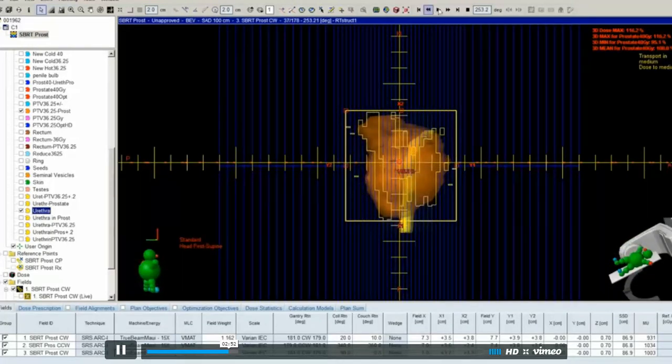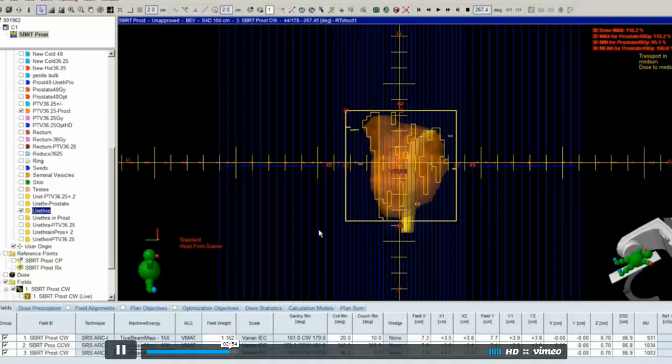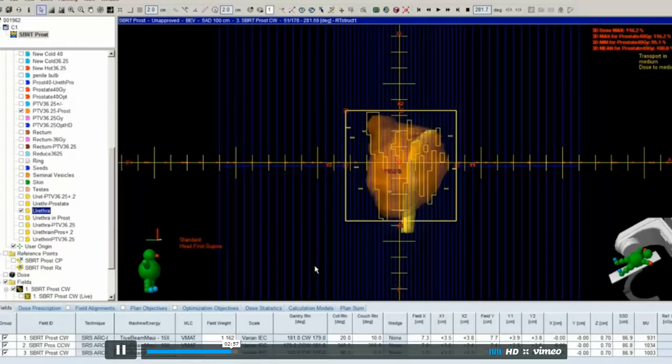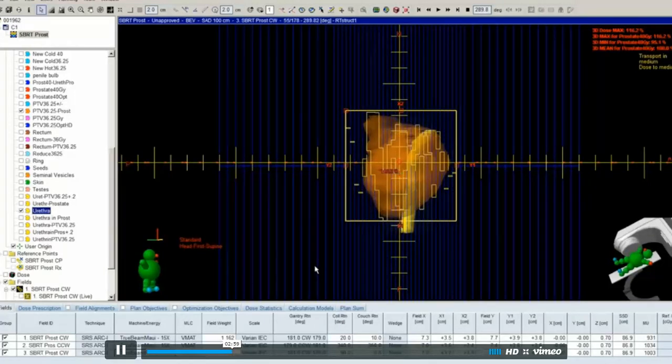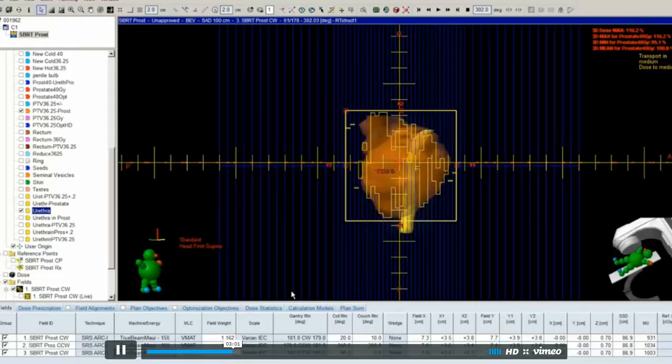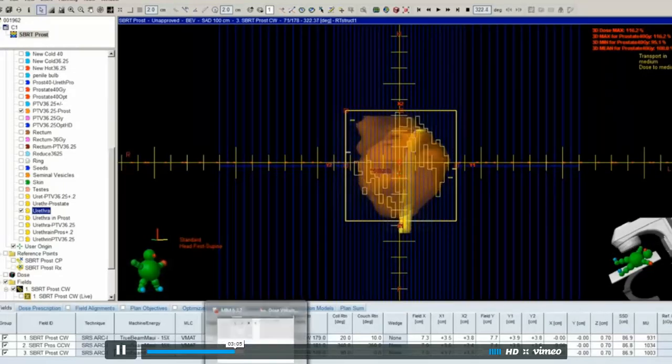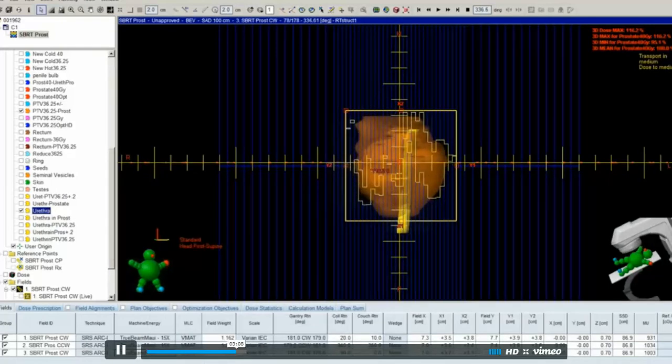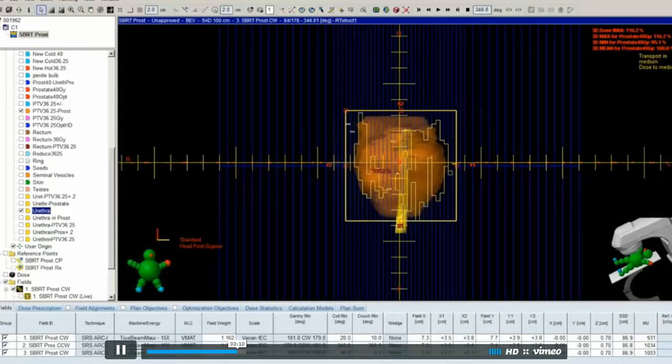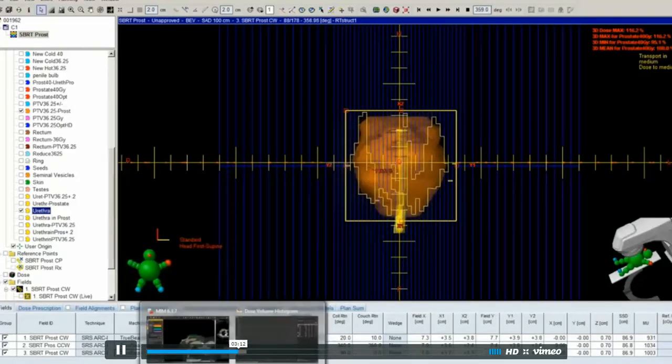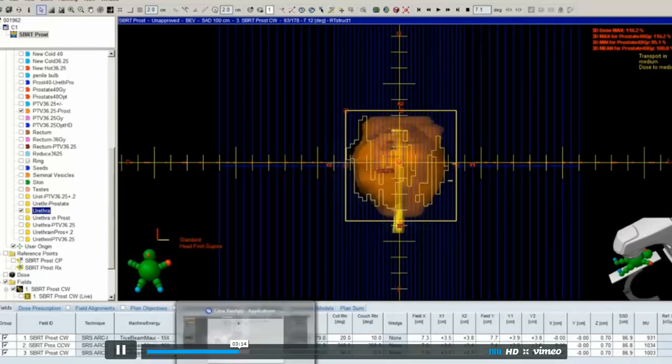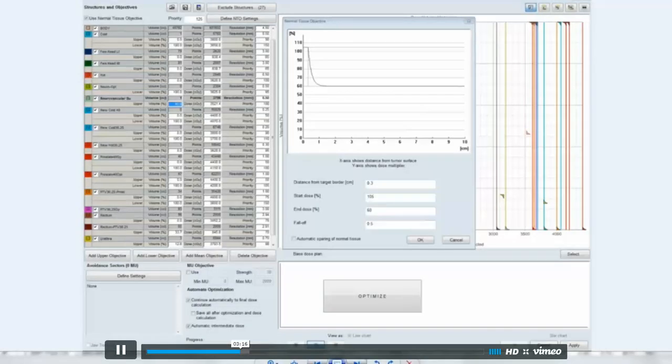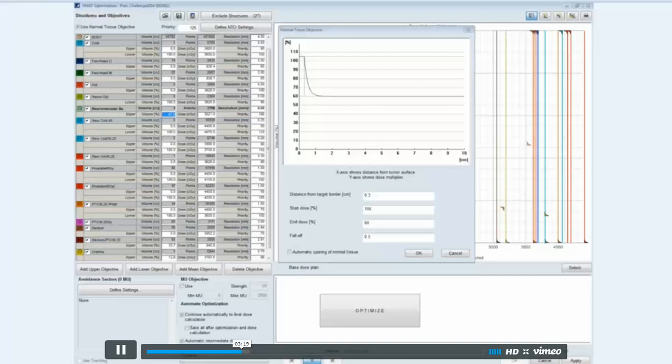As far as optimization, what I like to do is start by placing constraints on the targets alone, and let the optimizer just give it time and fully optimize on the targets alone until I'm satisfied with what that looks like. I keep it paused on step one until the targets are fully optimized.